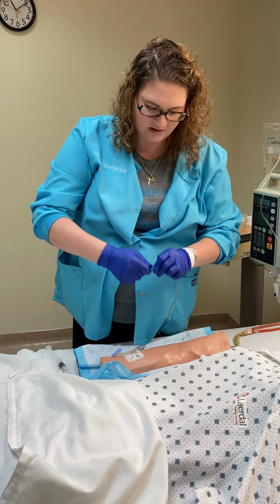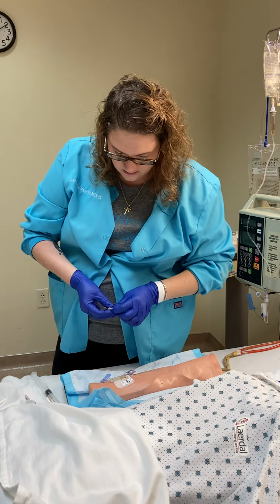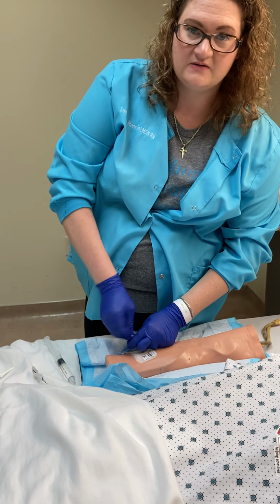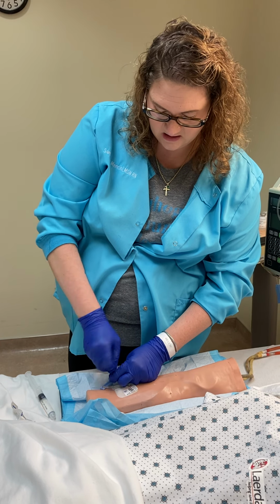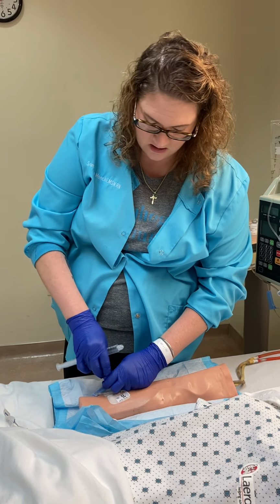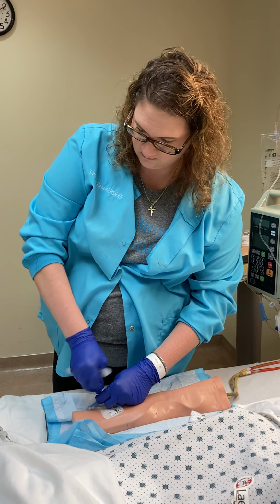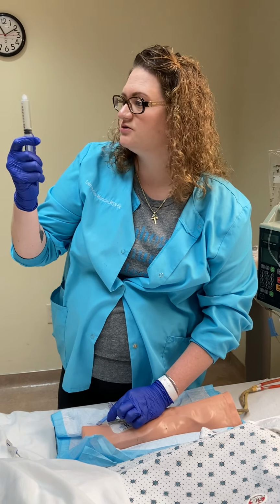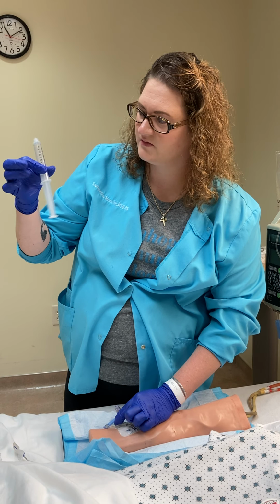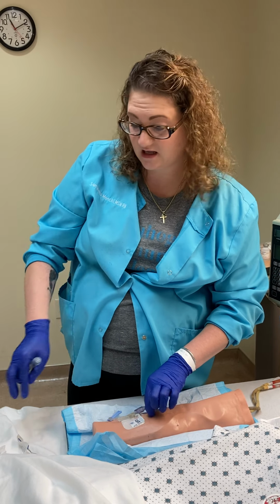I'm just going to put a cap on the end of it here. Okay. So for this one, I disconnected my line. I'm scrubbing for 15 seconds. And then I'm just going to flush. Make sure we get all of our bubbles out. Now be mindful, if this drops, I need to clean it again. So if I drop it, I have to clean it again with a new swab.